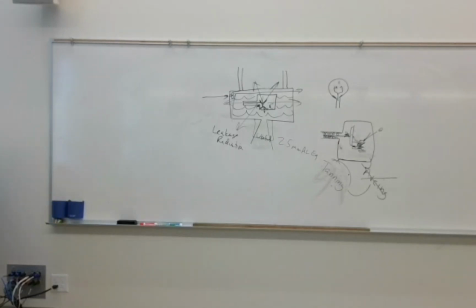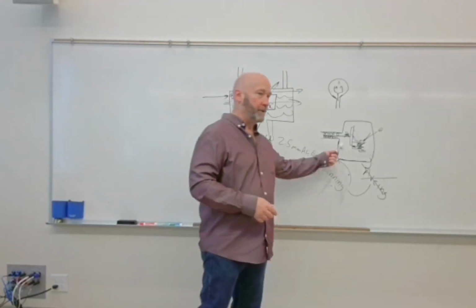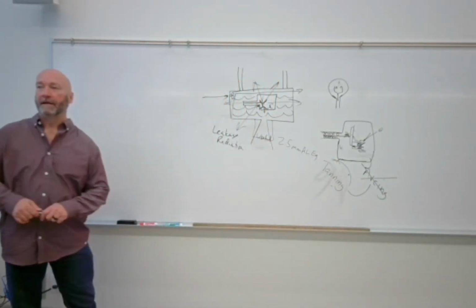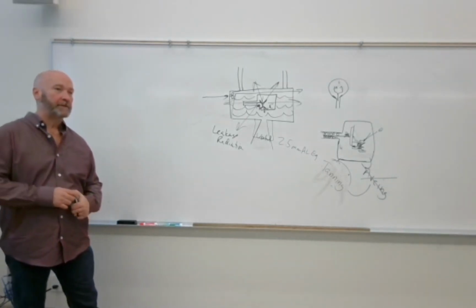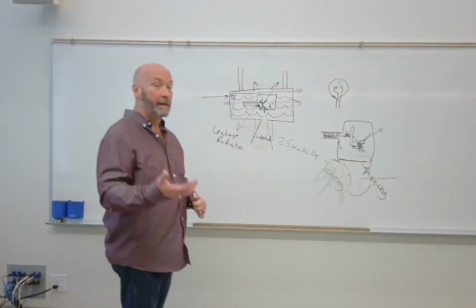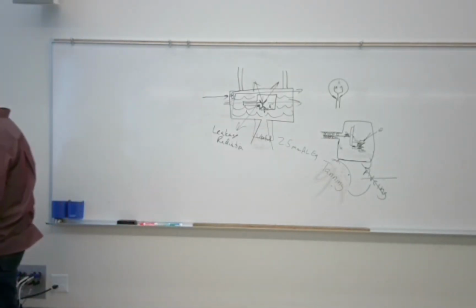We do have two possible types of anode. We've got a rotating anode. That's what you're going to use, rotating anode. You're never going to work with a stationary anode unless you work in a dental office. Low exposure, low heat creation, you can use a stationary anode. You're never going to work with one of those.